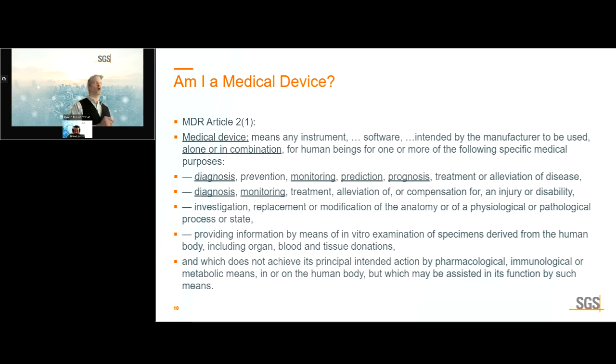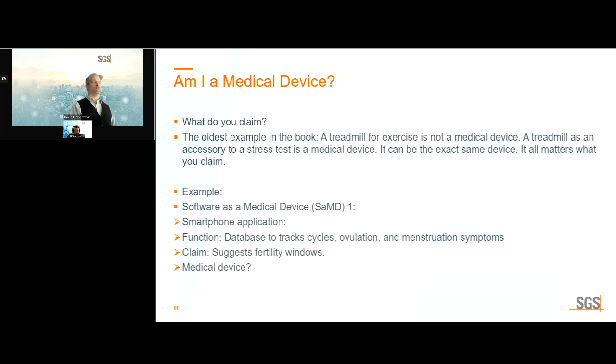So when you are thinking your way through, am I a medical device? Be very careful with the word monitoring. Be very careful with the word diagnosis. It may apply to you even when you don't think it does. So let's take this treadmill example and start moving forward through a couple of examples of, am I a medical device?